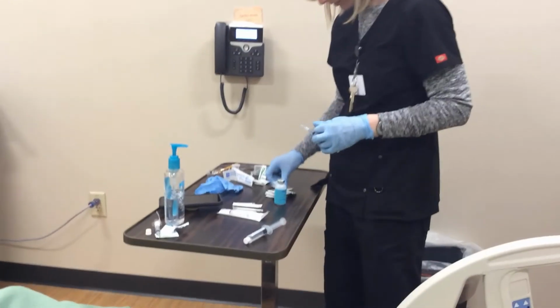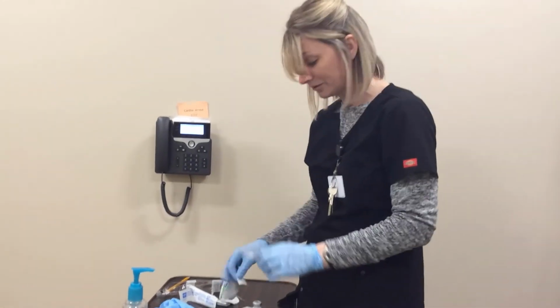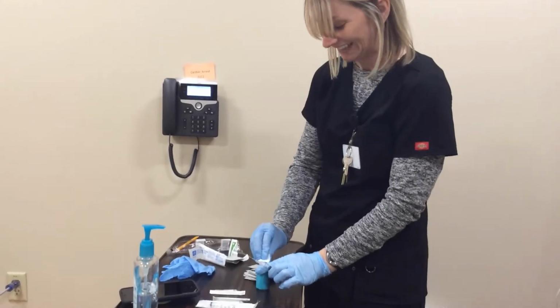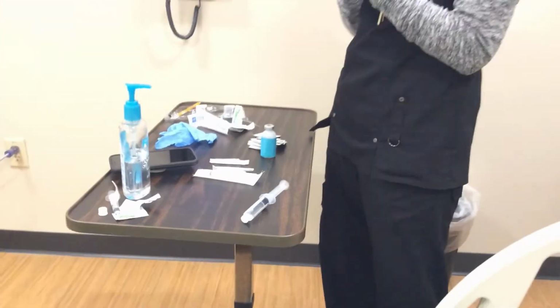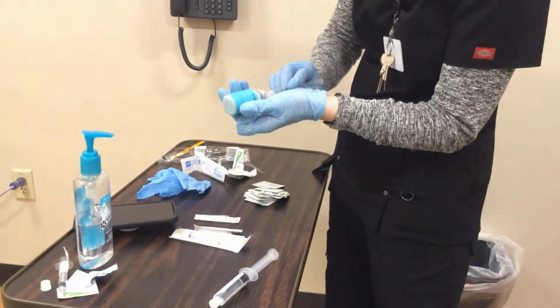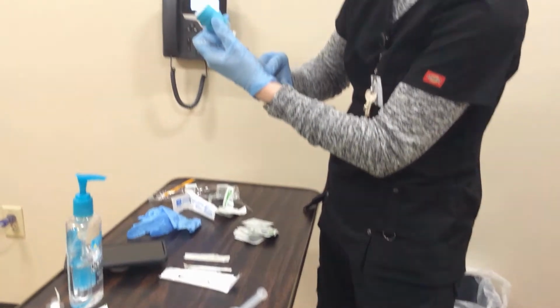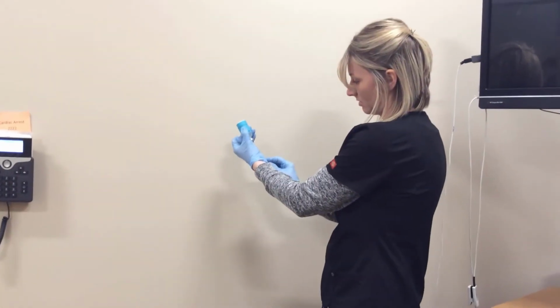I think you clean it off, right? If ever you don't remember if you clean it off, what do you do? You clean it off again. All right, I got it cleaned off. I'm going to pull that tissue. Go ahead and put it in there, and that one in there is super easy because this has been used a few times, so I know I'm going to make a mess here. But typically that won't happen.